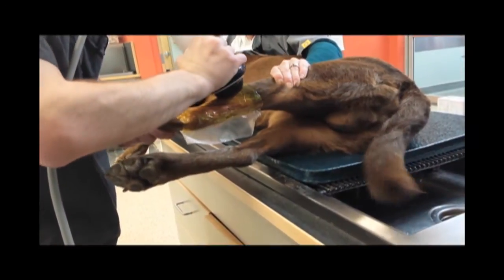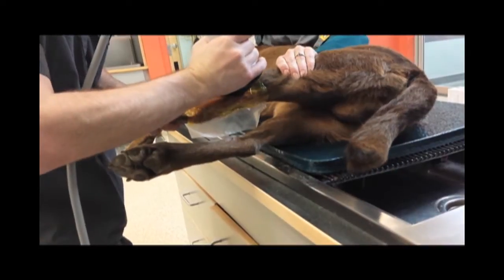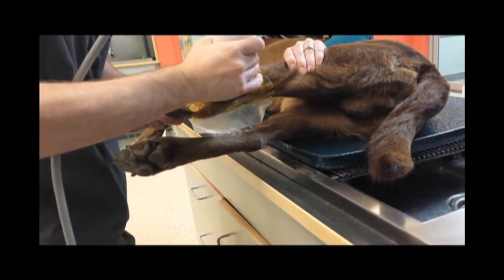In this video, we see the trode being passed back and forth over the tissue in question. In this case, it's the Achilles or calcanean tendon.